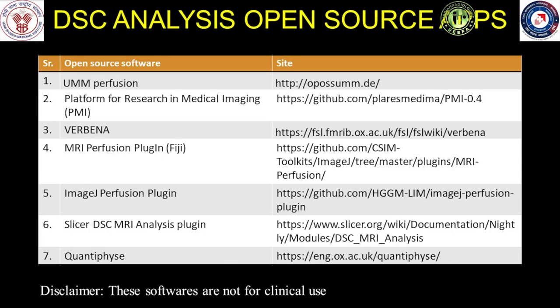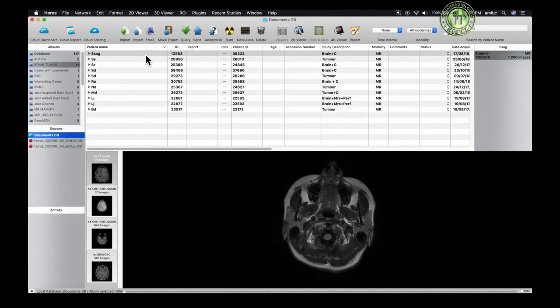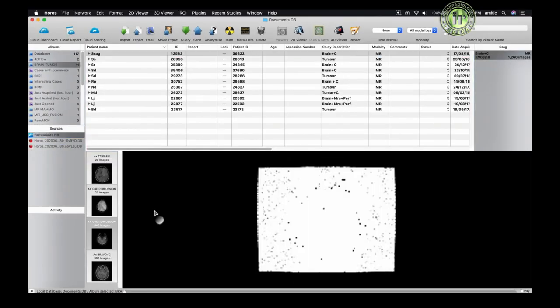Once perfusion acquisition is made, analysis can be done on vendor-provided software on the console or extended workstation, or on open source software like UMM Perfusion on Horos or OsiriX on a Mac. For perfusion analysis, open the perfusion sequence in the 4D viewer in OsiriX or Horos.